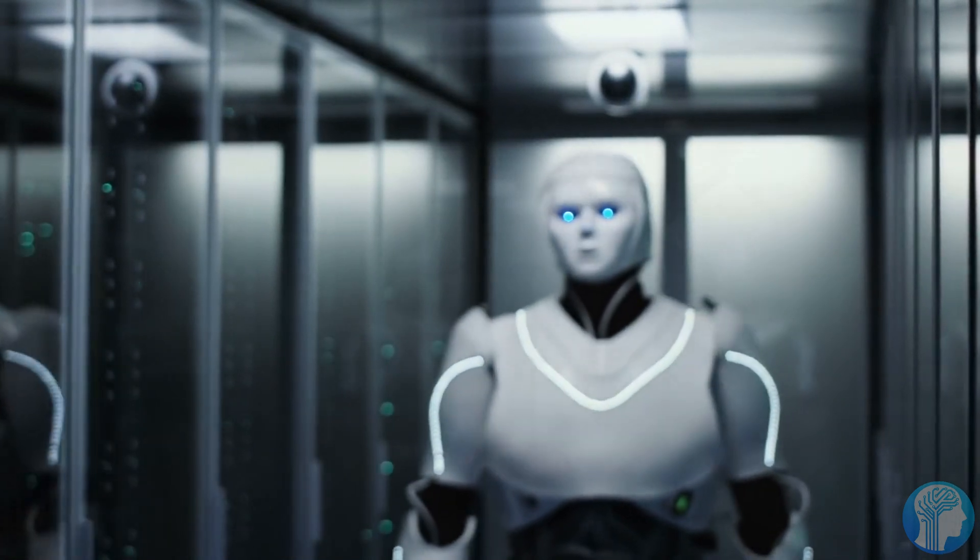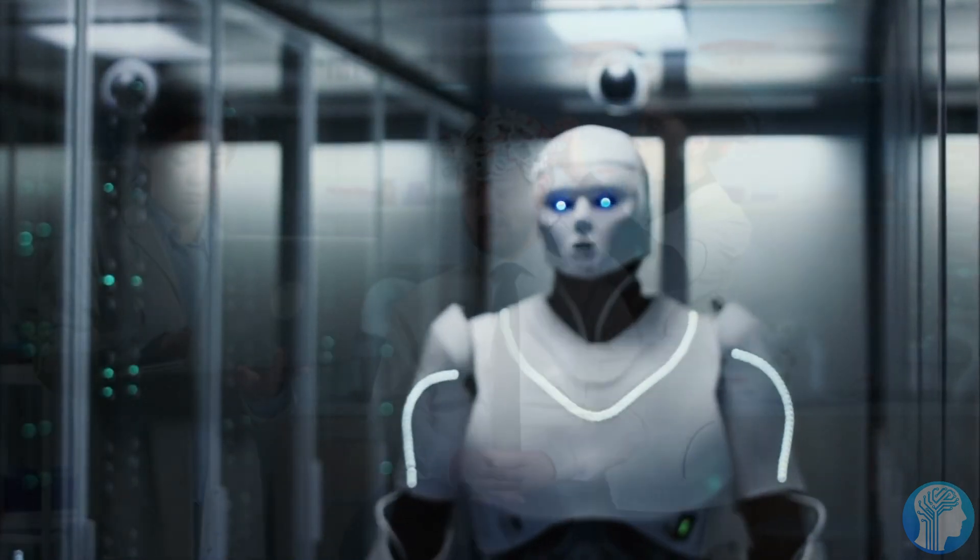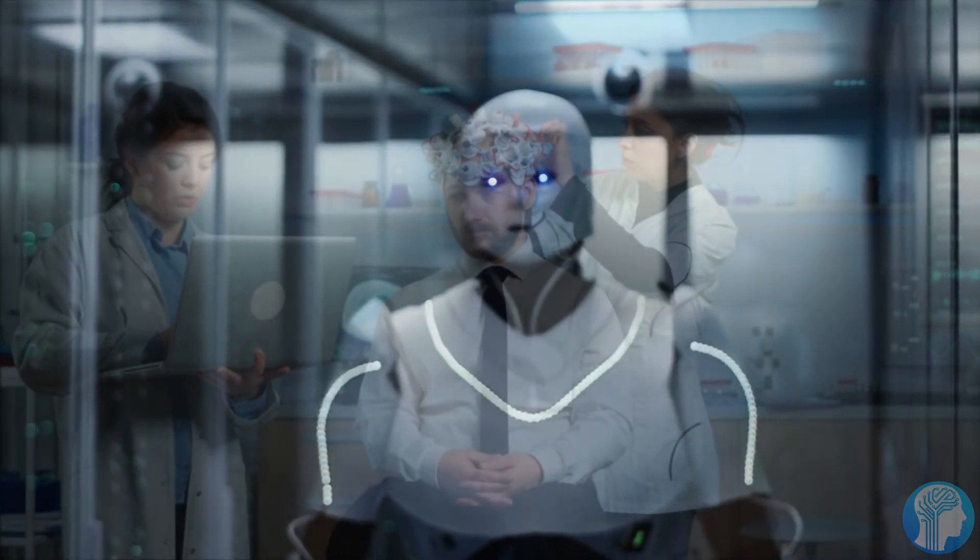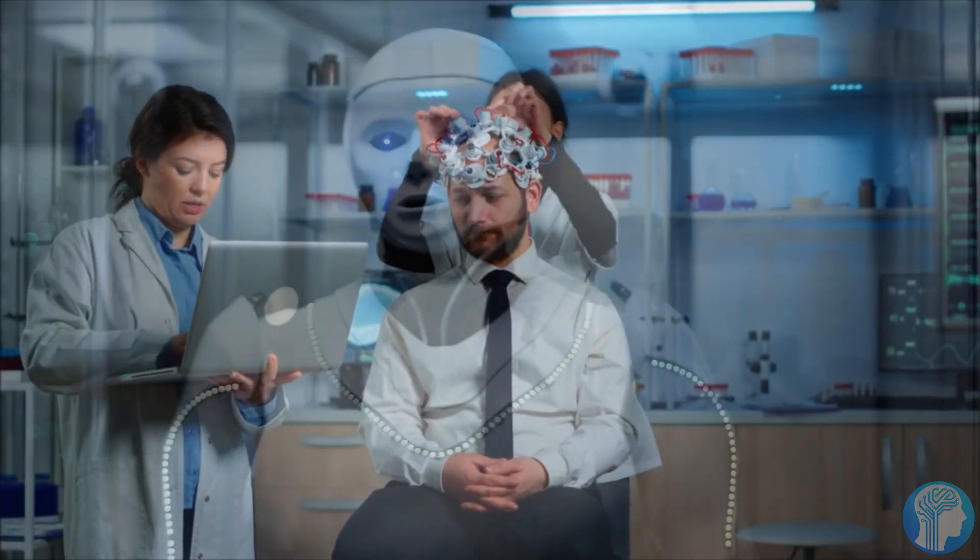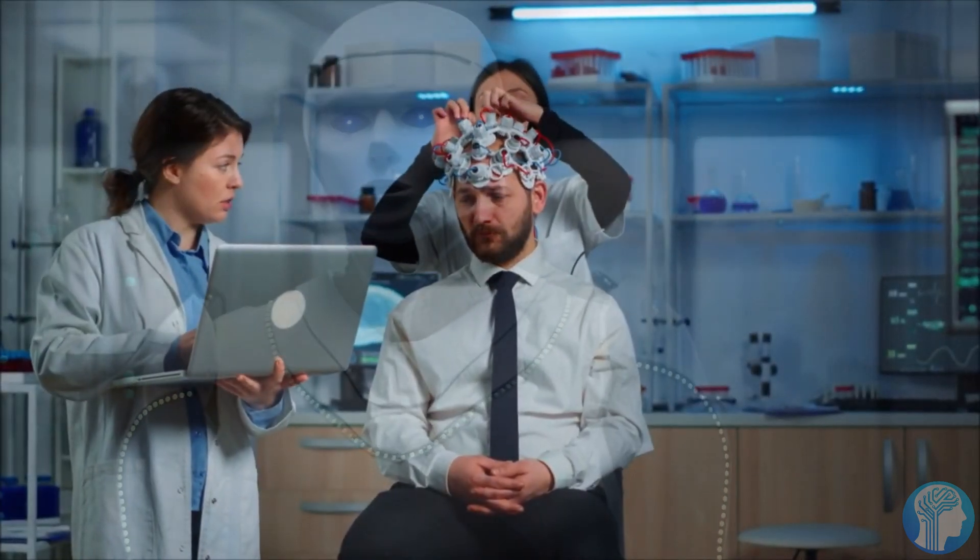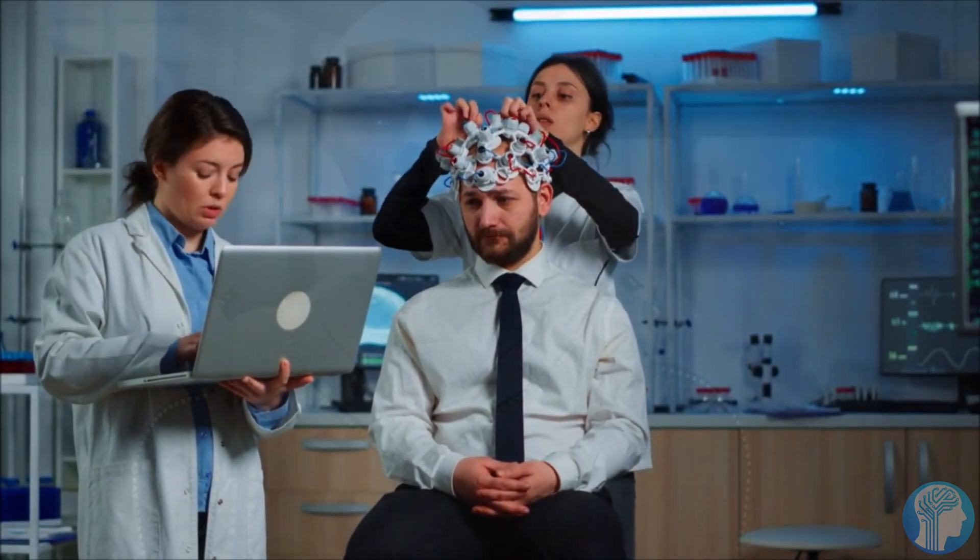The BCI converts the incoming signals into a hand movement and then sends commands to the prosthetic hand to accomplish that action.